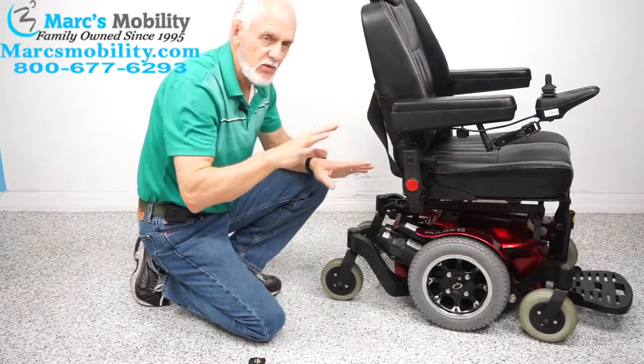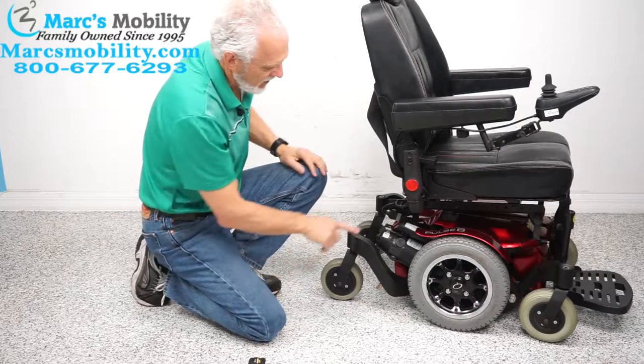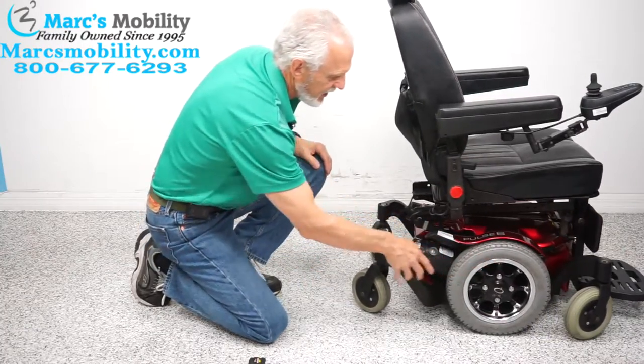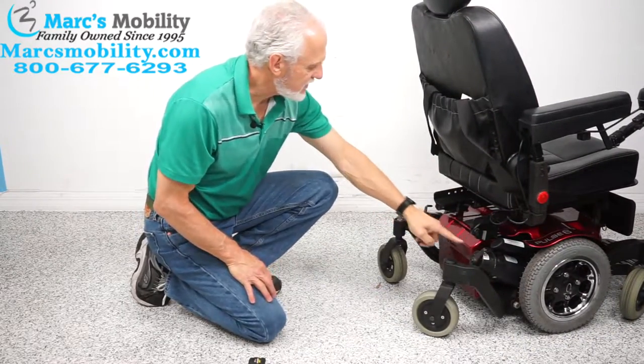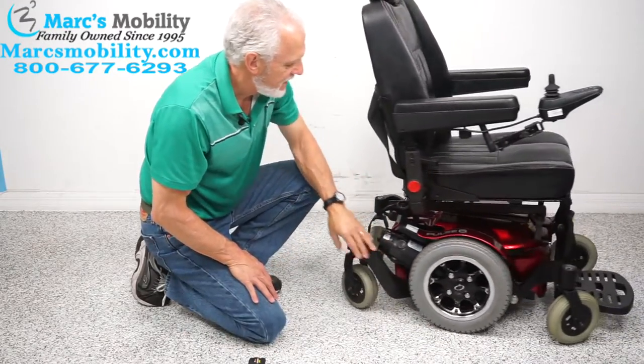There's a handle on top of the motor. If you want to put the chair in neutral, turn the power off first — you want no resistance in the motor. Then there's a lever right here; push it that way and you're in neutral. See how easy it rolls now. You have one motor on each side; you have to do both motors if you want to roll straight.